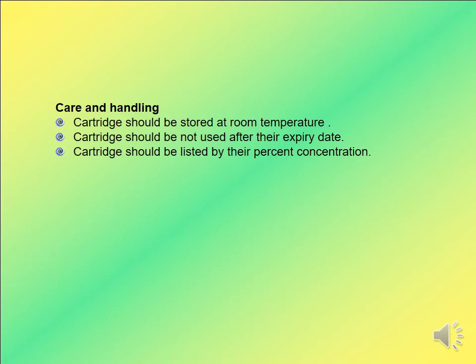The expiry date that is written on the glass of the cartridge is very important. Do not give any expired local anesthetic solution, and it is listed by percent concentration.